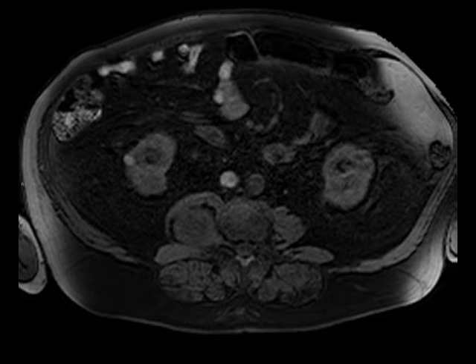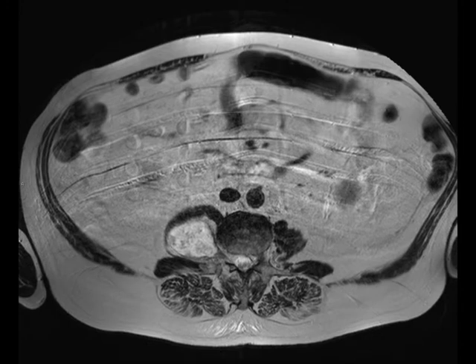This is a young male who underwent screening upper abdominal MRI with and without contrast, demonstrating a fusiform-shaped, T1-moderately heterogeneous, T2-moderately heterogeneous lesion with both hyper- and hypo-intense components extending from the L2 nerve root on the right. The tumor extends towards the L2-3 neural foramen. The lesion partially effaces the psoas muscle on the right, and there is evidence of subtle scalloping of the far-right lateral aspect of the L3 vertebral body, suggesting that the lesion is long-standing.